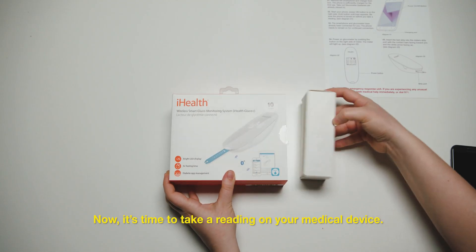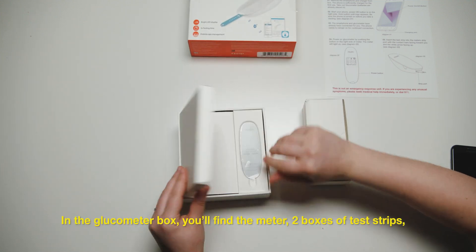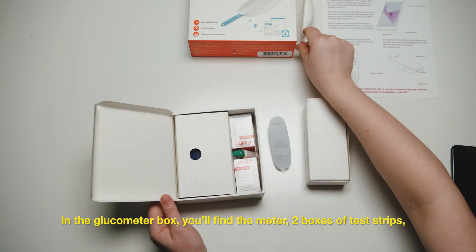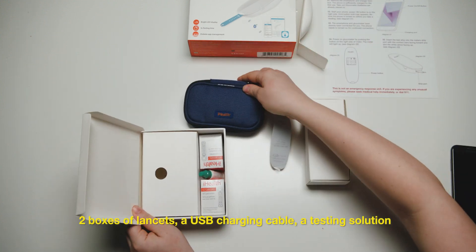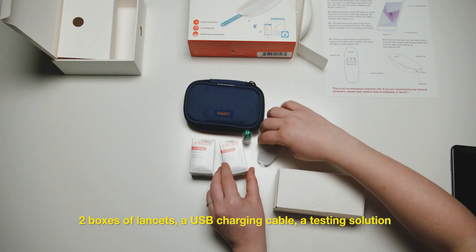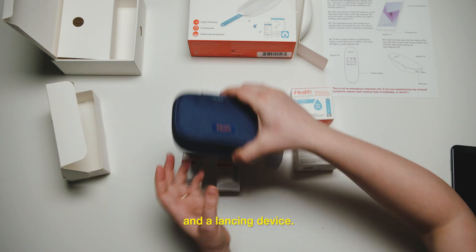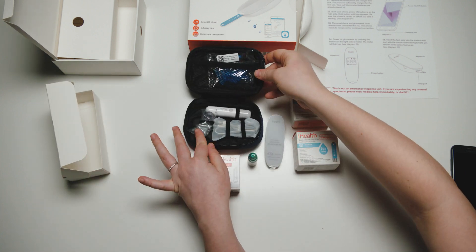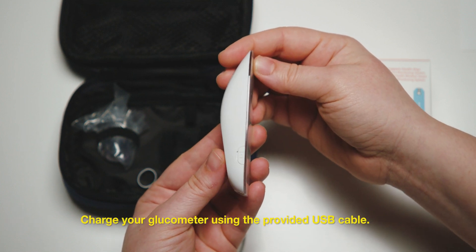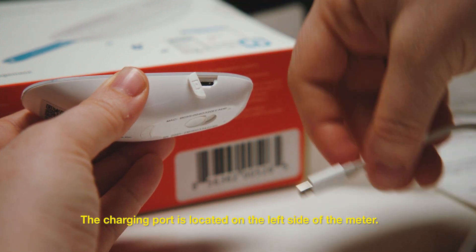Now it's time to take a reading on your medical device. In the glucometer box, you'll find the meter, two boxes of test strips, two boxes of lancets, a USB charging cable, a testing solution, and a lancing device. Charge your glucometer using the provided USB cable. The charging port is located on the left side of the meter.